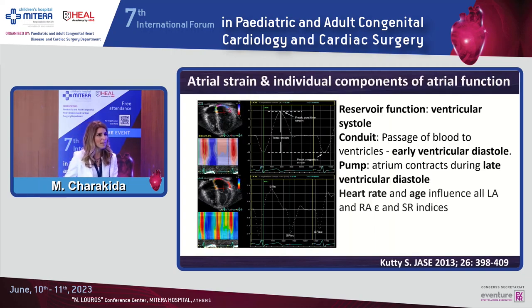But we can use speckle tracking also to assess atrial function, and it's an area of interest, especially in adults. Depending on the cardiac cycle, if we have ventricular systole, we can assess the reservoir function of the atrium, in early ventricular diastole the conduit function, and in late ventricular diastole the pumping function.